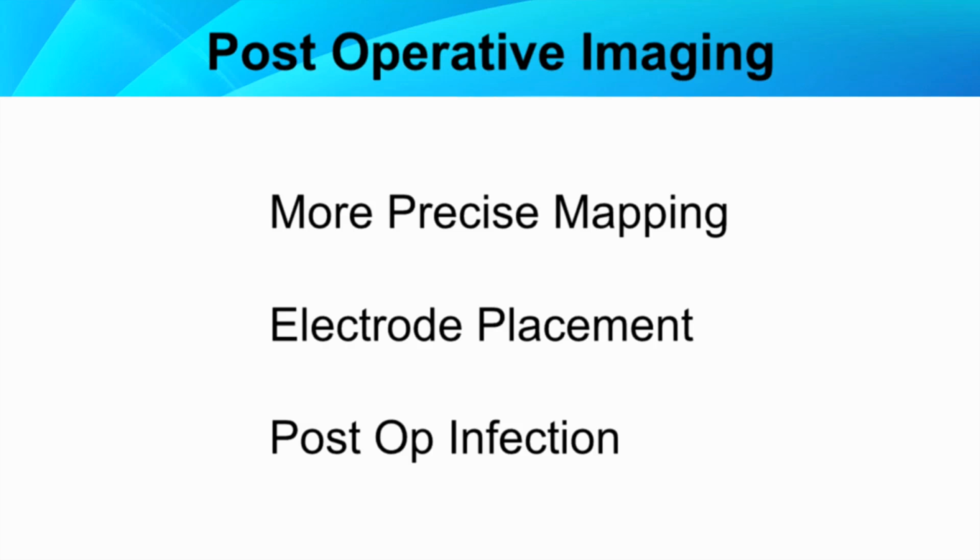And finally, imaging is often utilized for the postoperative assessment of cochlear implant recipients. Sophisticated techniques are now becoming available to allow one to determine whether or not the electrode is within scala vestibuli or scala tympani. A cutting-edge use of postoperative imaging is to determine the exact location of individual electrodes within the intracochlear scalae. Precise electrode location can be used to improve programming of the electrode array.